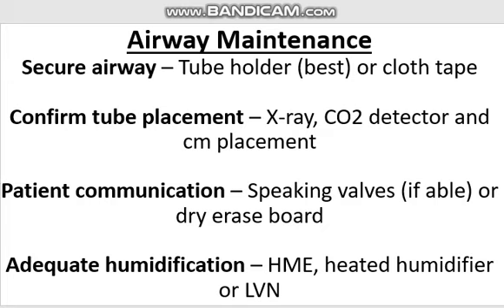Airway maintenance. Secure the airway. The tube holder is best, or use cloth tape. Confirm tube placement with an X-ray, CO2 detector and the centimeter placement. Patient communication, such as speaking valves if able, or a dry erase board.